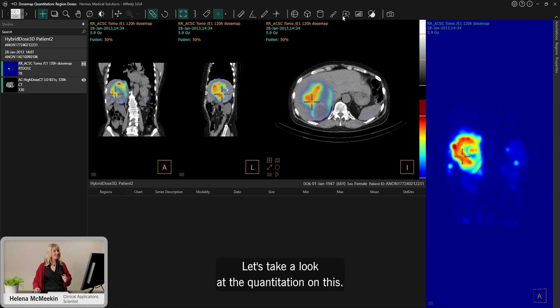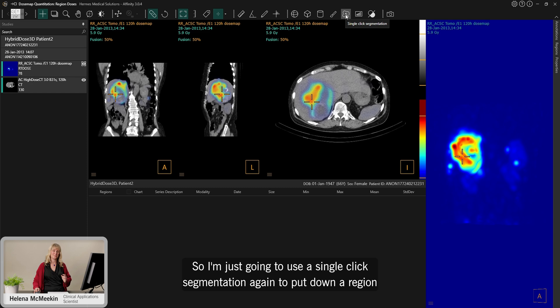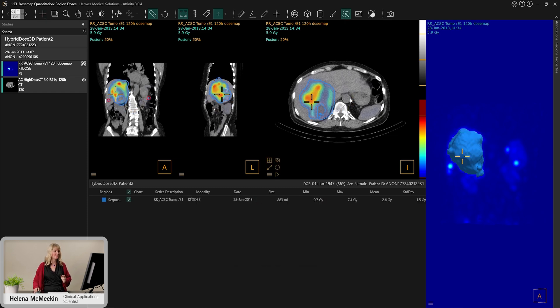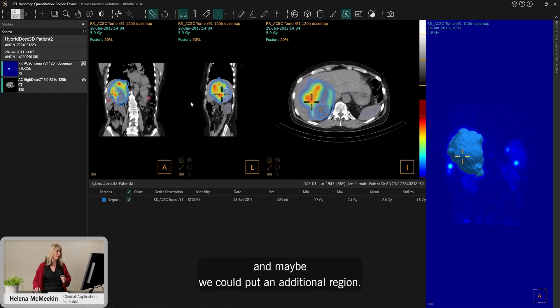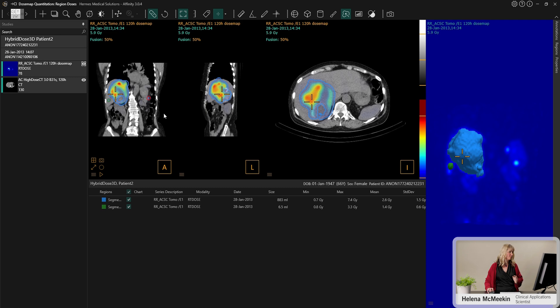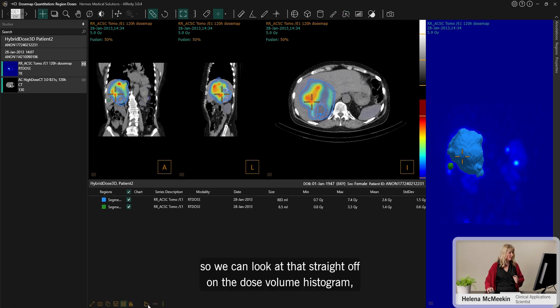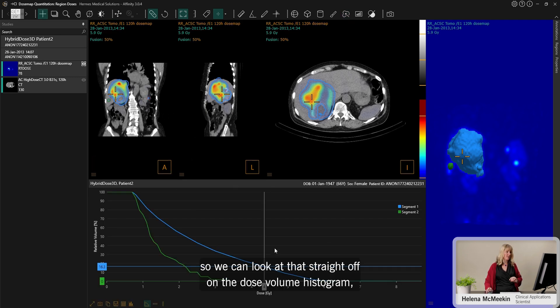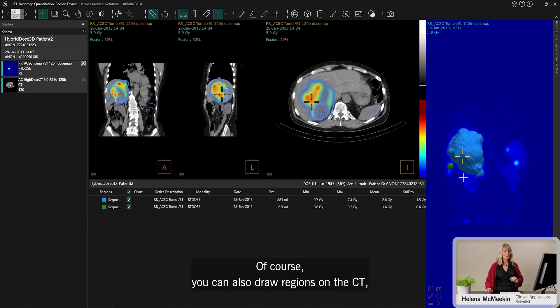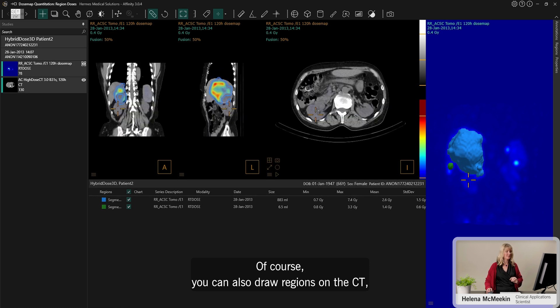Let's take a look at the quantitation on this. I'm just going to use a single-click segmentation to put down a region over this liver tumour, and maybe we could put an additional region here as well. So we can look at that straight off on the dose volume histogram, or we can take a look at the dose stats in the table. Of course you can also draw regions on the CT.